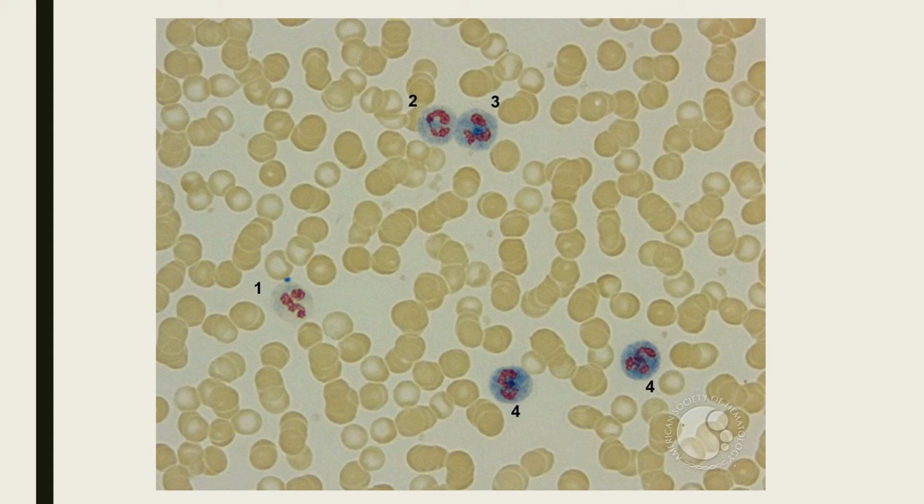For 2 plus there are a few blue granules present. For 3 plus, it is stronger and we can see a clumping of blue granules. And for 4 plus, it shows the strongest blue color compared to the previous 3 neutrophils.